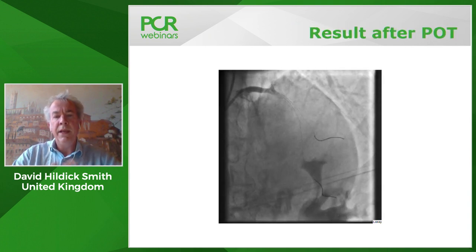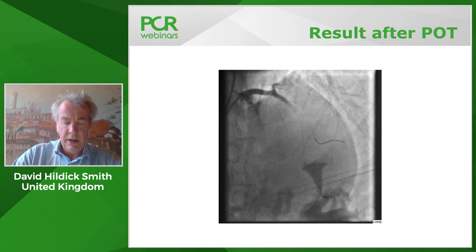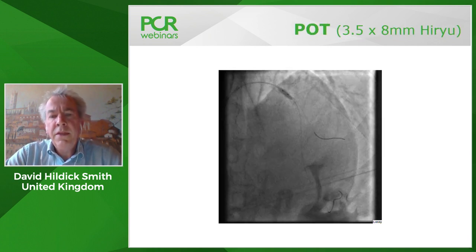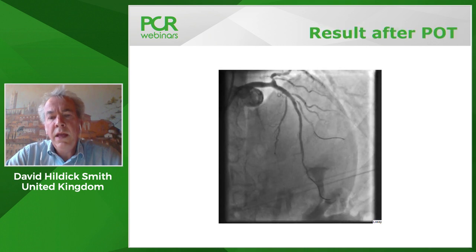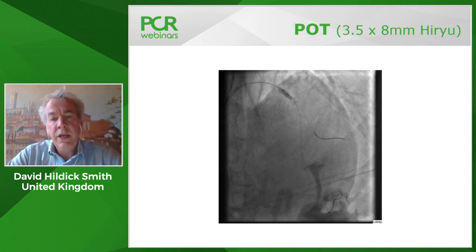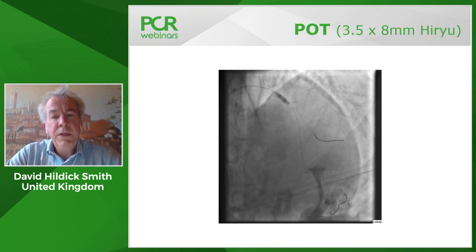So the pot, I think, can we just show the previous slide here? I think that if I'm looking at this and understand, just go back to the previous slide, please. If we look at the balloon position here, it appears to be too proximal.